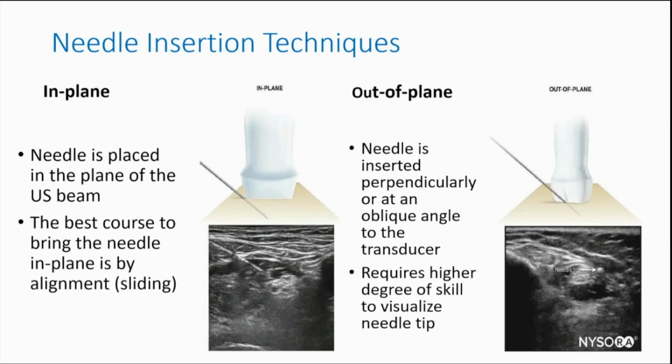In the ICU, the Acusons, I think even the one in Dahlia hybrid, both of them have time gain compensation, so that can help. But I do not turn it on whenever I want to do procedures. If I want to scan and look at structures, then I would turn it on. But usually I do not turn it on for procedures per se.